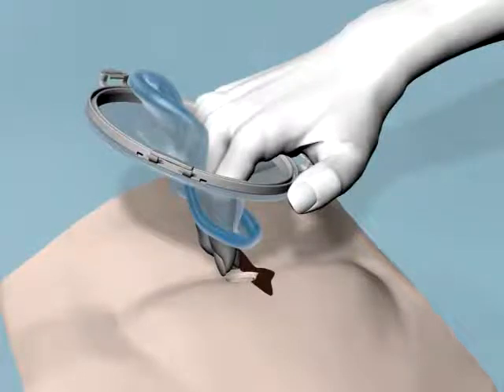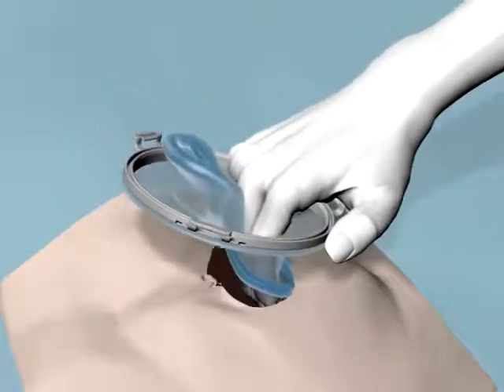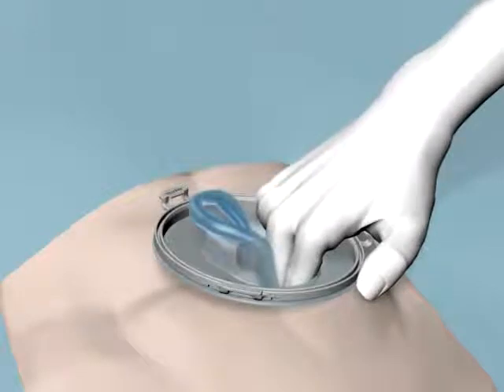While grasping the bottom and upper retractor rings, insert the bottom retractor ring through the ipsilateral side of the incision deep into the peritoneum while the upper retractor ring is anterior to the skin.